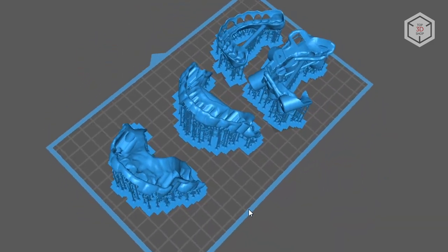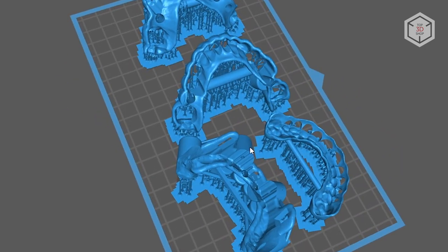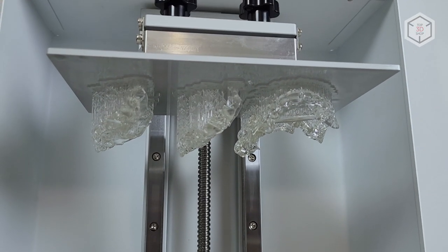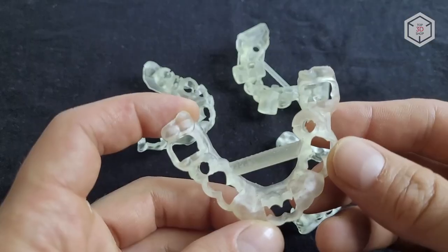We printed three regular surgical templates of slightly different types and one template for gingival surgery. All models were suspended on supports since they do not have a single flat surface, being subsequently rinsed and post-cured. And here are the results. Nothing broke off from the supports.